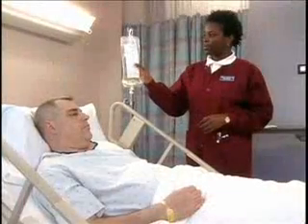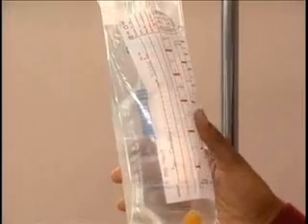Okay, now Jeannie and I had a situation today with her patient when his IV was not running. Right, Jeannie? Yes, he had an order for a normal saline solution to infuse at 100 cc's an hour via a gravity system. Tamika, what would you do in this situation? Well, I would confirm the IV solution and rate of infusion with the physician's order. Good. Then I'd verify the solution contents of the IV that is infusing and check the tubing for kinks, pressure points, and blockages. And what would she do next, Robert?